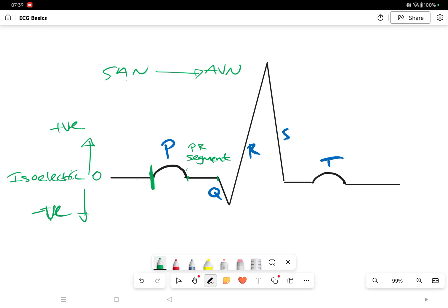You'll appreciate the importance of these deflections when you are looking at ECGs and you recognize, for example, that a lead was placed on the body incorrectly whilst trying to take an ECG, or in situations when we have, for example, deviation of the axis. These are all things you'll pick up later.